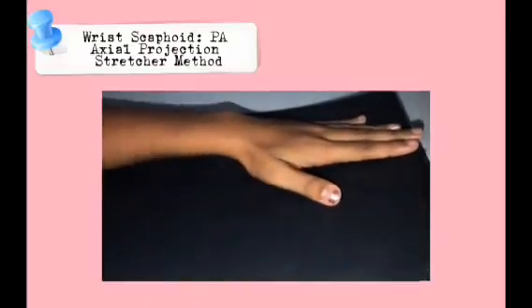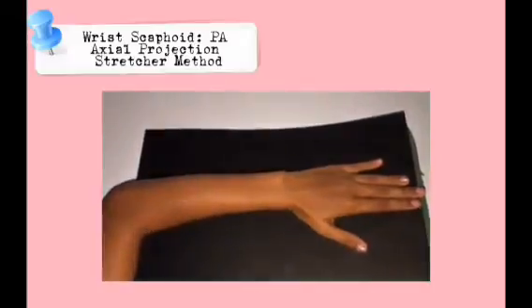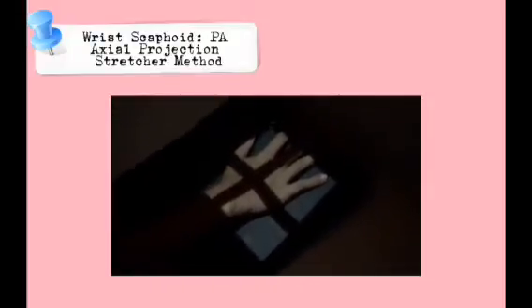Position of part. Place one end of the IR on a support and adjust the IR so that the finger end of the IR is elevated 20 degrees. Adjust the wrist on the IR for a PA projection and center the wrist to the IR. The central ray is perpendicular to the table and directed to enter the scaphoid.